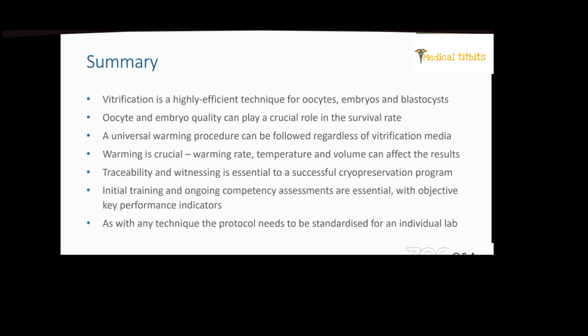Traceability and witnessing are essential to secure the success of a cryopreservation program. Initial training and ongoing competency evaluations are essential using objective KPIs. And as with any technique, the cryopreservation protocol needs to be standardized for each individual lab.